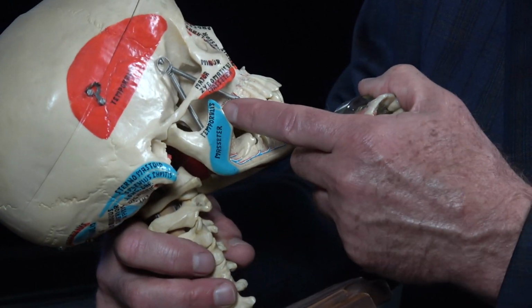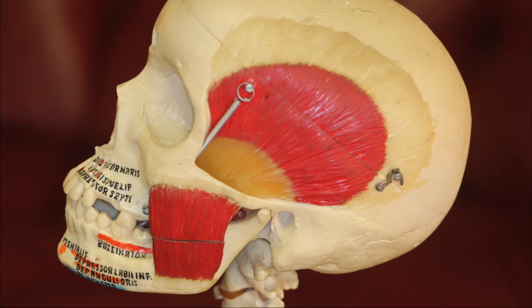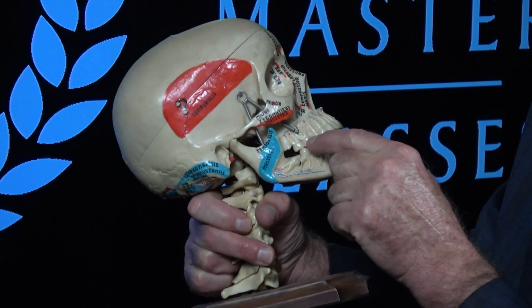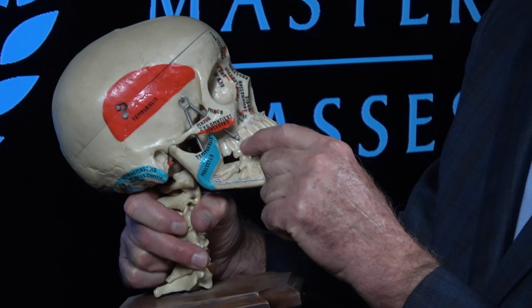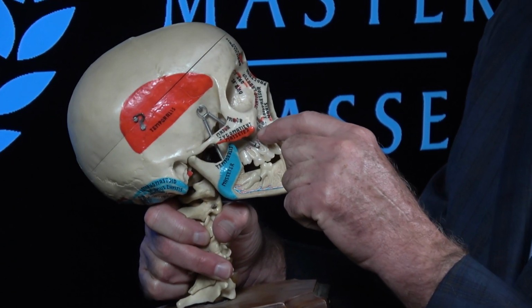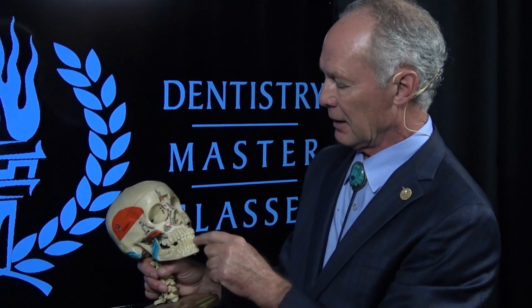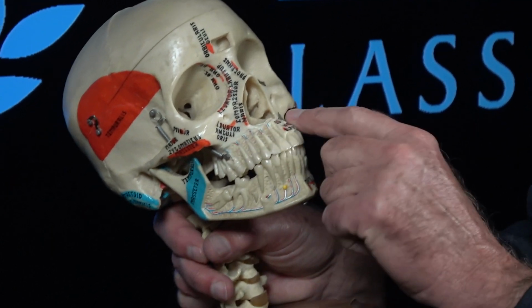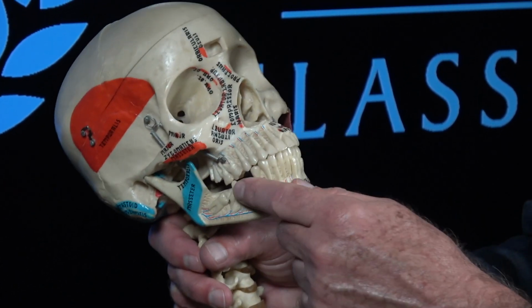And in the maxilla, you've got a sinus up here on both sides. And so if you have enough bone from the top of the bone or the top of the alveolar crest to the floor of the sinus, then you can place an implant in the posterior part of the upper jaw or the maxilla. There's usually not much of a problem in the anterior part of the mouth, the anterior maxilla or the anterior mandible. Now, what are the advantages of each?